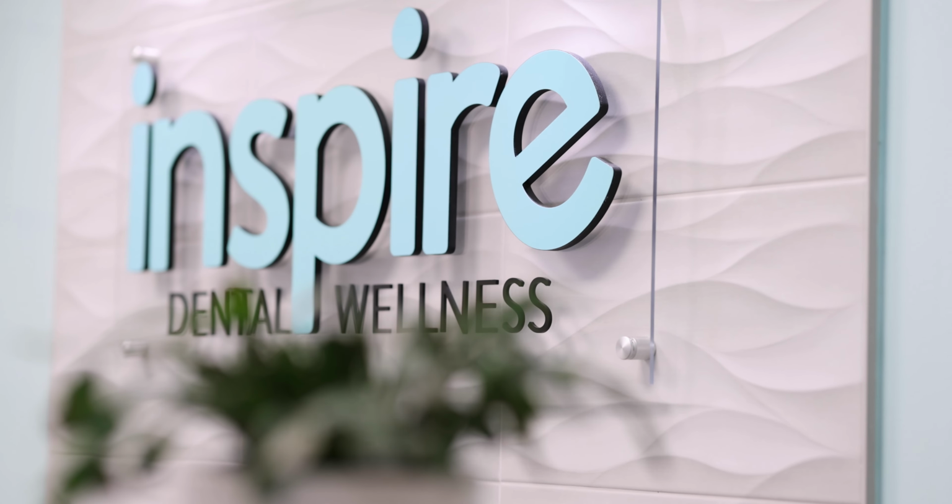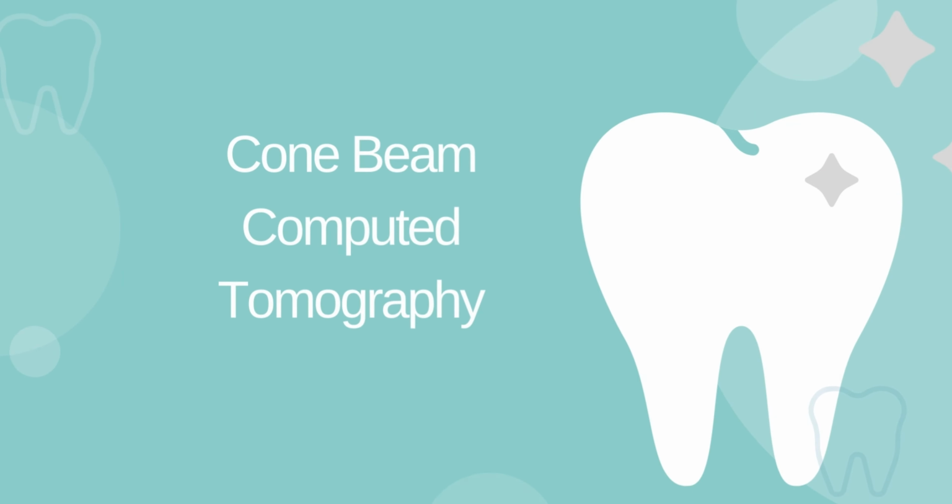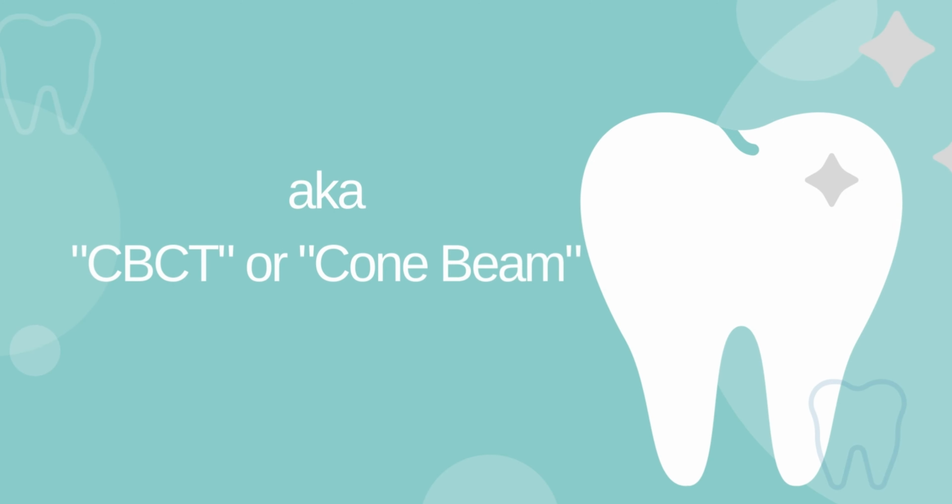Today we're going to talk about cone beams and your airway. The technical name for a cone beam is cone beam computed tomography, which is a really long word, so we call it either a CBCT or a cone beam. Basically, it's a 3D x-ray that we take from pretty much your neck all the way up to the top of your skull.